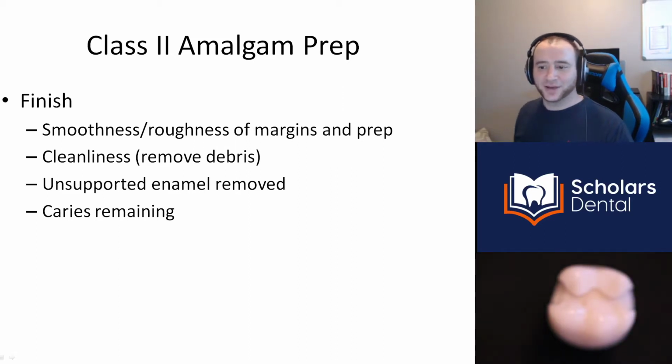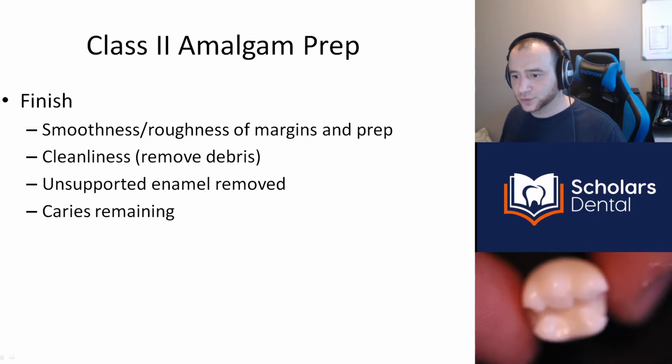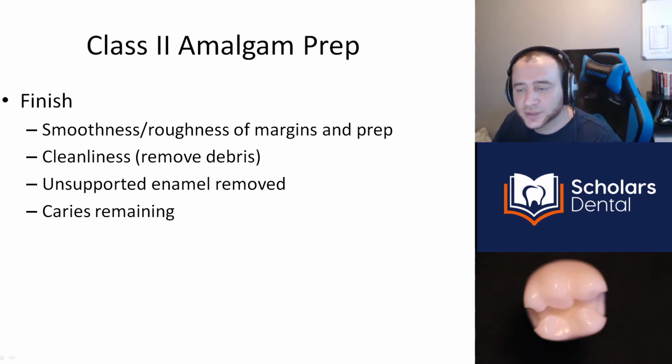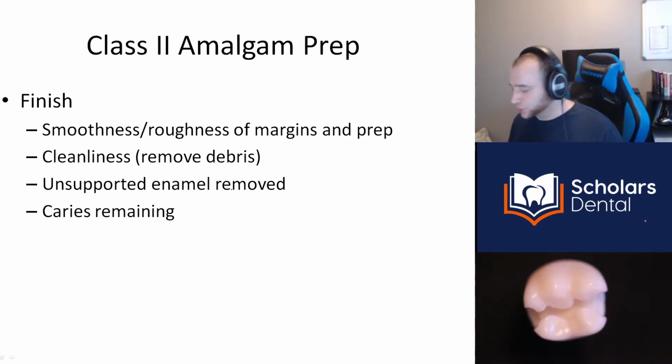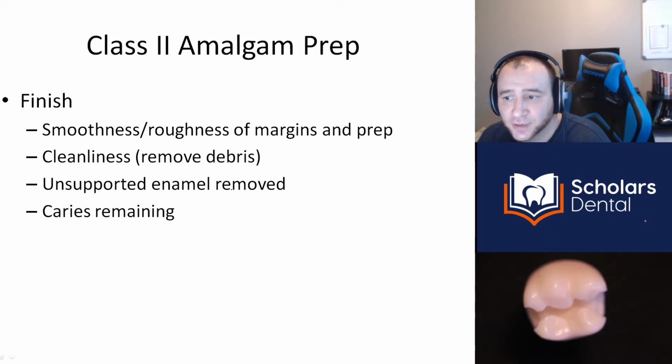All right, welcome back. Now we made it to the third column, which is the finish for the class 2 amalgam prep, according to the NDEB criteria. And this column is the one you really want to master because it'll help you in other projects as well. So finish includes four things here you can see. Basically smoothness, roughness of margins, and prep.